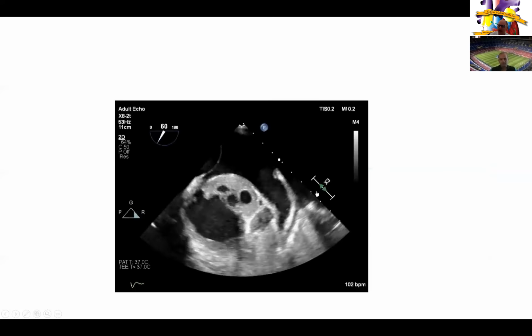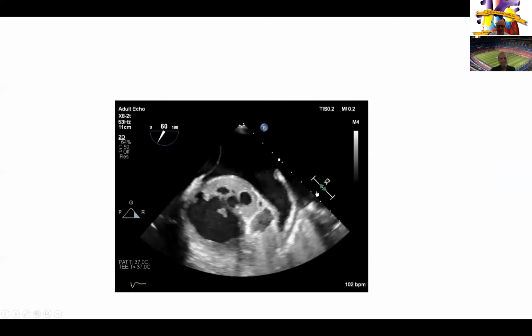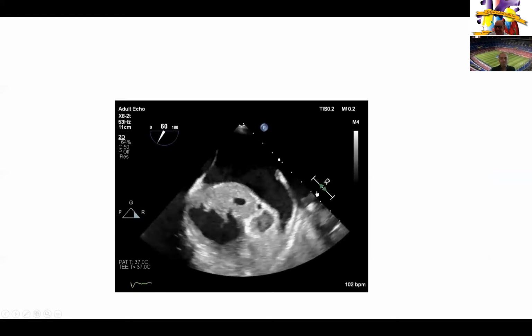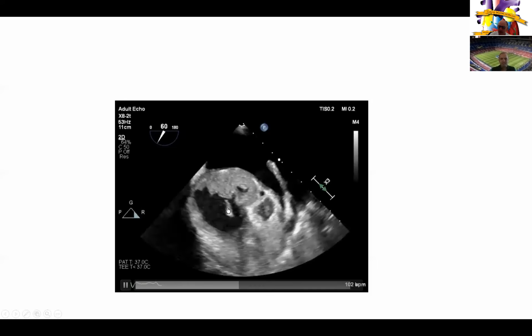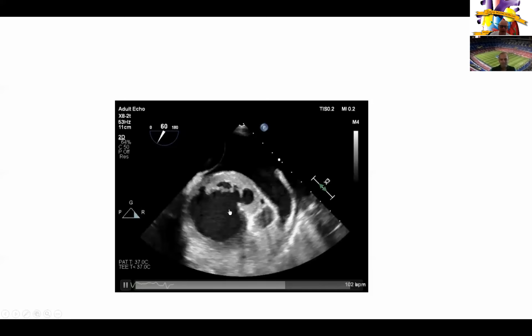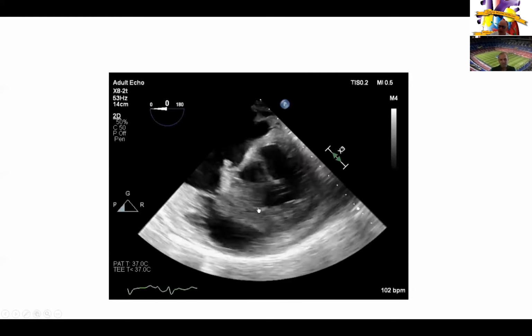Let's track this. So now, Deb, this is your favorite organ, the atrial appendage. You're going to spend the next 2 years of your life putting things in it. You can see the appendage, but you can get a better appreciation of that large abscess. You can see how far posteriorly and laterally it tracks. You see that? With a lot of cavities in it, abscess cavity, pus, some mobile echo densities. Embolization as well, and that explains his cerebrovascular event, all these small emboli.